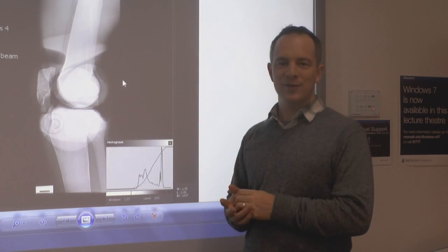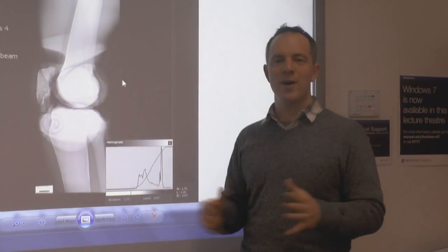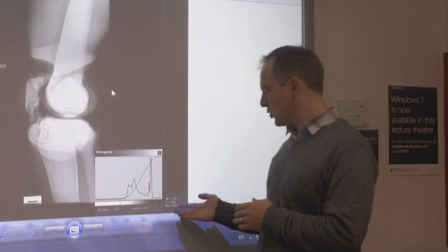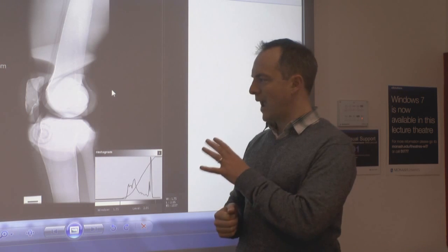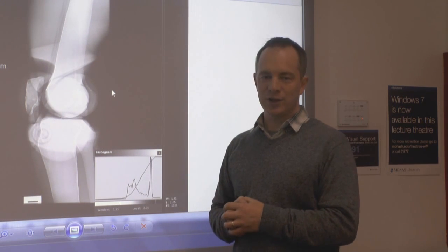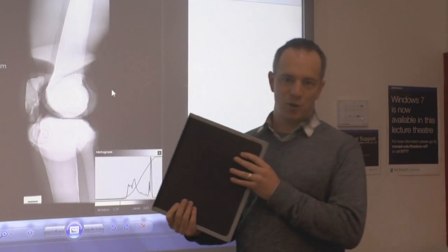So that's given the acronym DI instead. And that is one algorithm that all manufacturers must use. But most of the time you're still going to come across these exposure indices which are going to be specified for a specific manufacturer. And for each different anatomical body part, they'll have an ideal EI value for that specific type of system that you're employing.